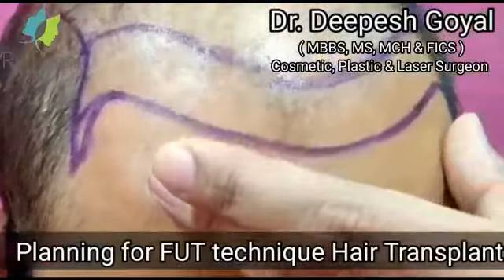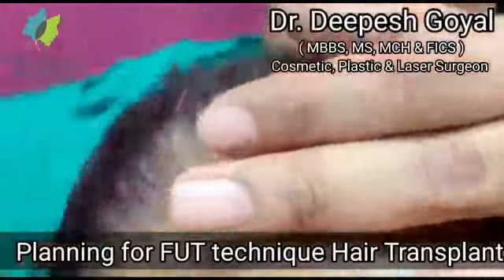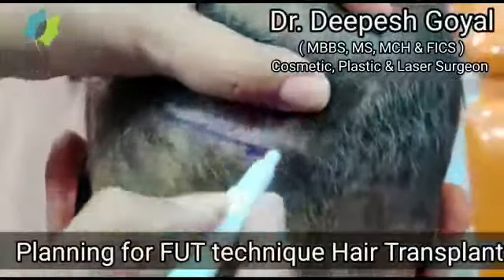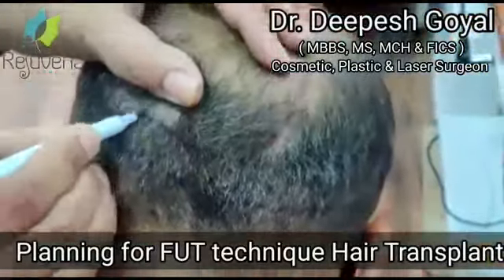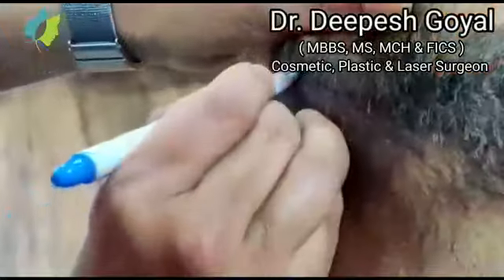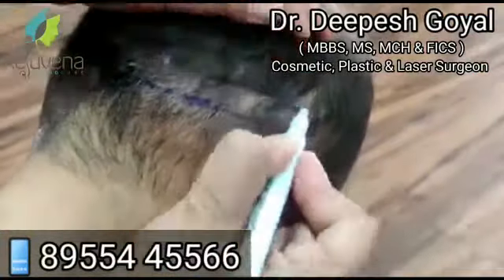First we will design the hairline at the scalp, and then we will mark the recipient and donor site for the hair strip. In this case we are taking around 1 to 1.5 cm width hair strip from the back of the scalp, where the permanent hair grafts reside. These grafts are lifelong and they are never going to fall.